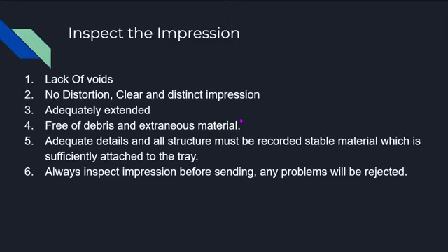Just like we explained earlier, if you send an impression to us that was not checked properly, with some layering on the impression, or some stretching on the impression, these impressions will be rejected. Or if there is not enough scan data, or the impression did not capture enough of the patient's oral data, then it is definitely going to be rejected.